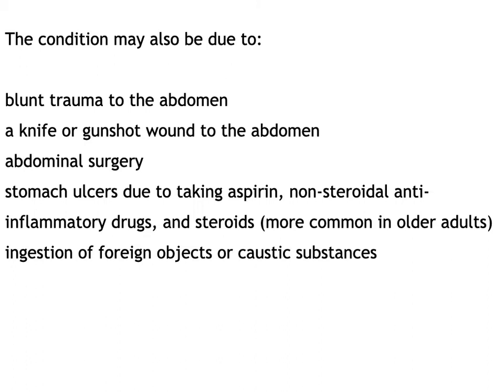Also, secondary to abdominal surgery, you can find this, but it should only be up to 72 hours. So if you have a patient after abdominal surgery with pneumoperitoneum, in this case gas inside the abdominal cavity, it's normal for 72 hours. After 72 hours, you have to suspect there is something wrong. It always depends on the amount of air the patient has in the abdomen. For 72 hours, a small quantity of air inside the intra-abdominal cavity is okay after surgery.